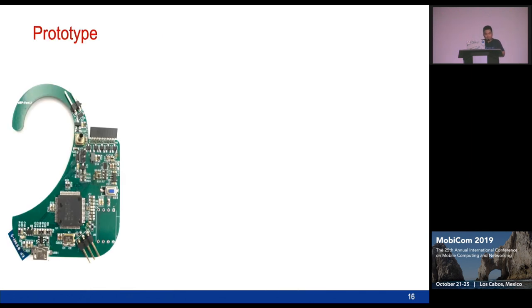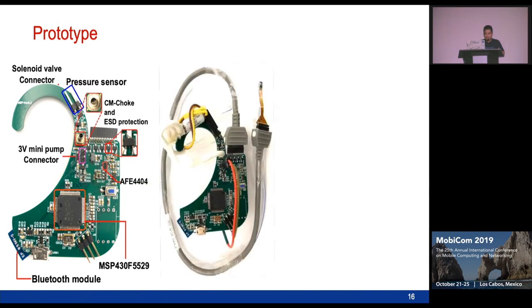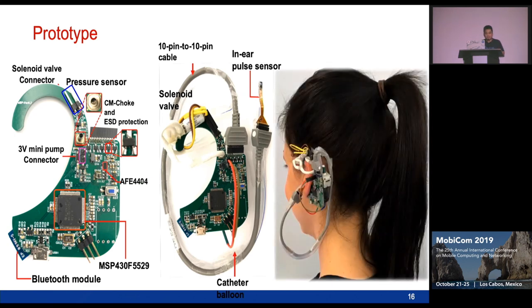This is how we build our circuit prototype. It includes all the components: the solenoid valve, the pressure sensors, and ESD protection to protect the circuit. We also include the driver for the PPG sensor. When we plug all the components together, this is how the full system works.